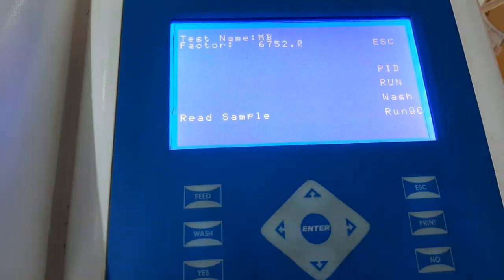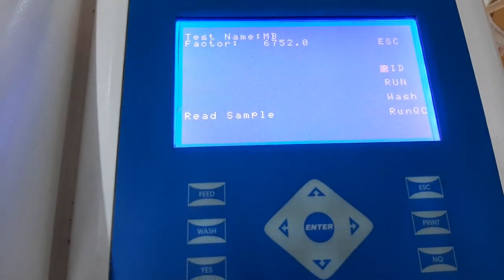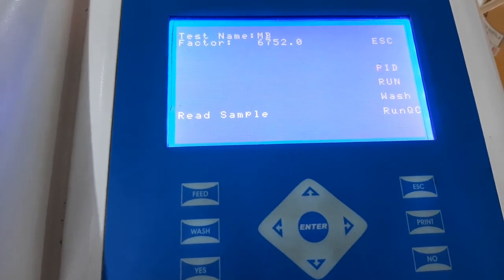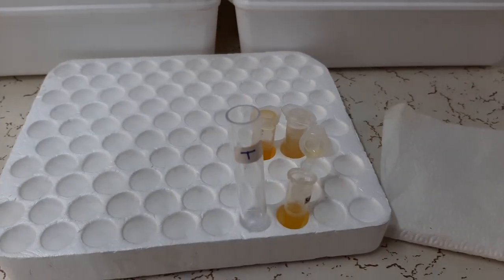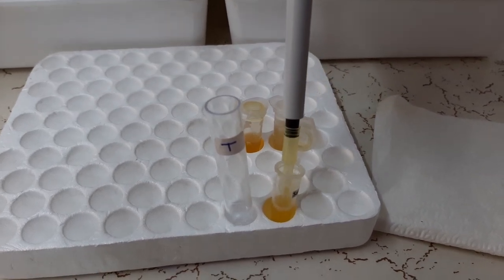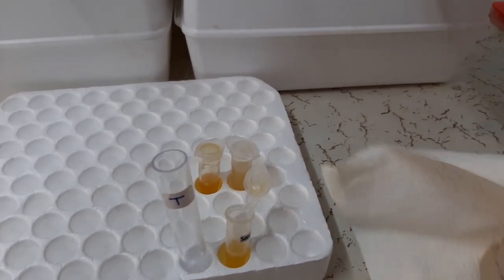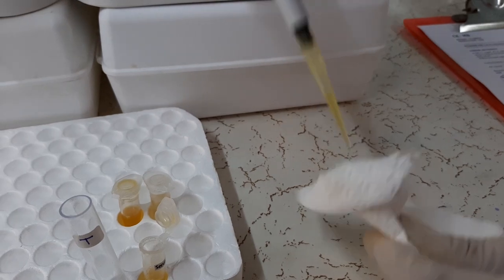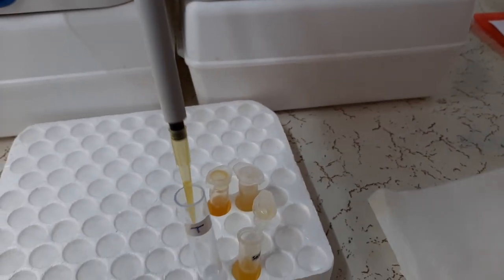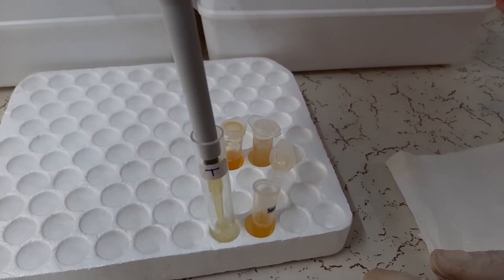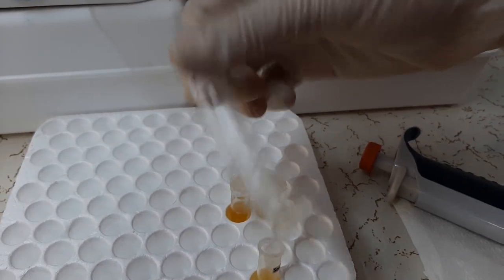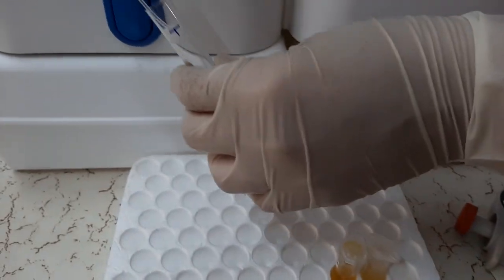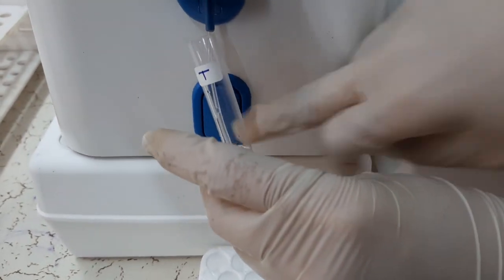Now, as you can see, the software shows the message read sample. So, now we will add the patient sample into the working solution. To do this, pipette 50 µL of patient sample and wipe the outside of the tip with a tissue paper. And then add the patient sample in the working solution. Mix it well and aspirate it into the instrument.